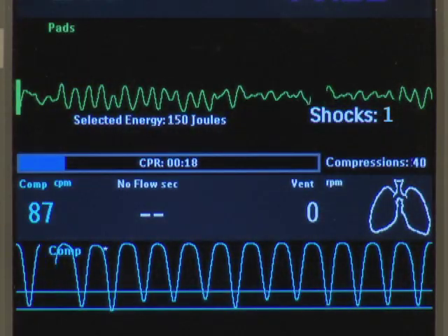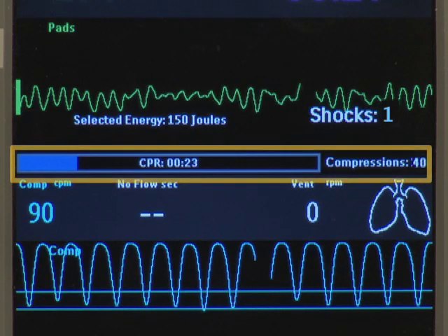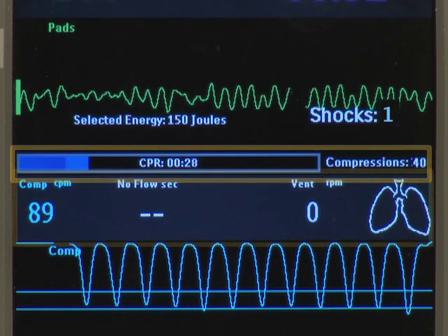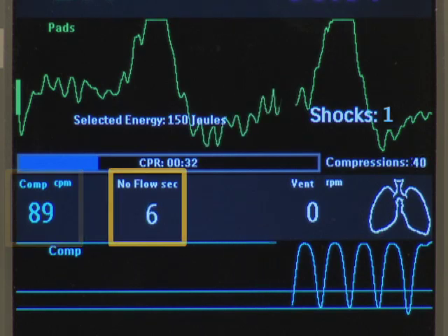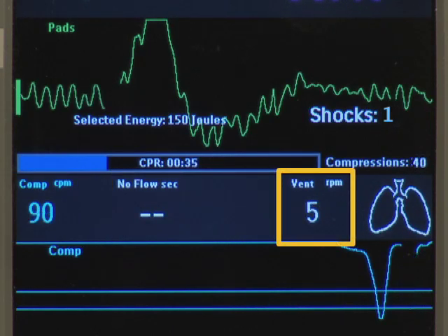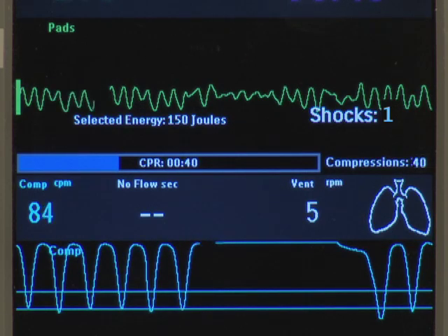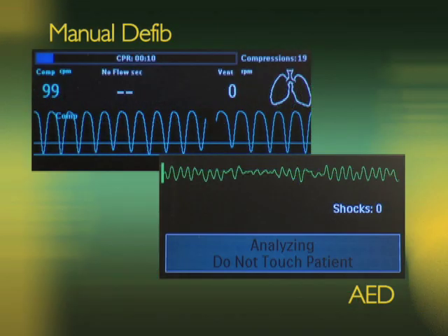At the same time, the HeartStart MRX displays CPR-related measurements. Here is the configurable CPR timer and compression counter. This area contains the numeric values for compression rate, seconds of no flow, ventilation rate, and a ventilation detection icon. The compression and ventilation rates are a moving average rate, measured per minute. Depending on the mode — manual defib or AED — and the AED CPR display configuration setting, the screen may look different.